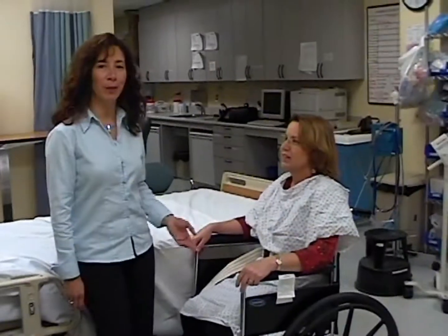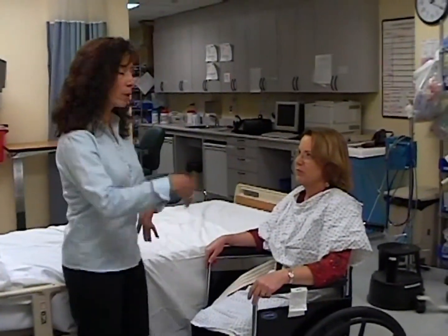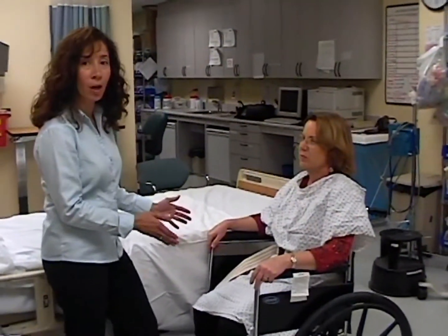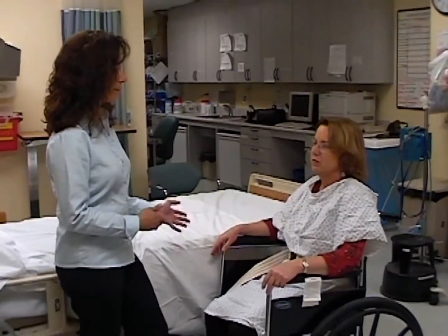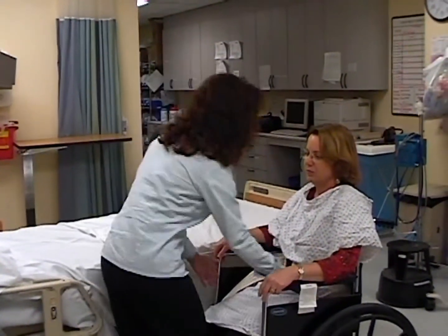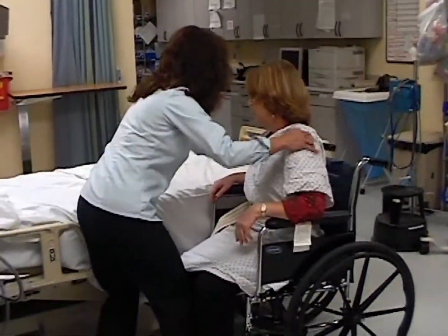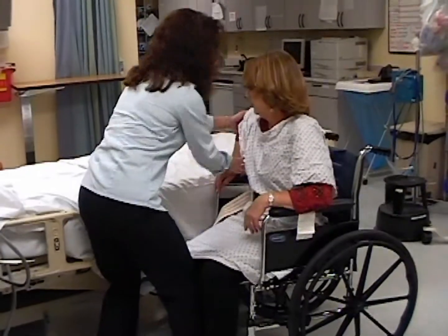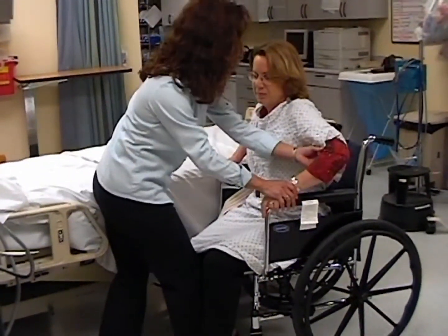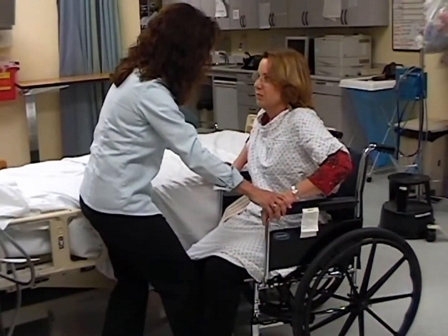Okay, so now we're ready to put our patient back to bed. Since we said this patient had a left side weakness, we're going to bring them back to bed on the other side. So we position the wheelchair with the right side, which is their strong side, closer to the bed. We want to make sure that the patient comes to the edge of the chair, and that they use their good strong arm to push off. Even if the other arm is weaker, we still want to reinforce them by touching the patient and telling them what we want them to do.